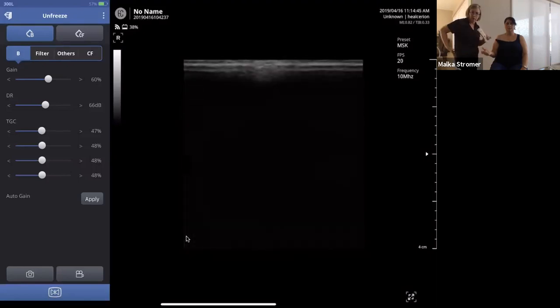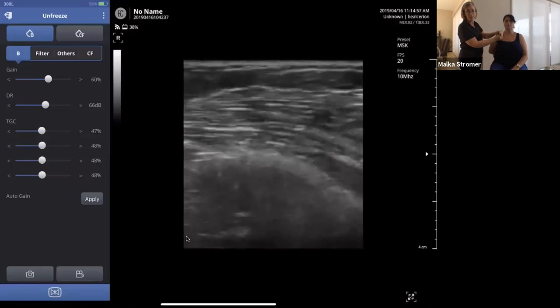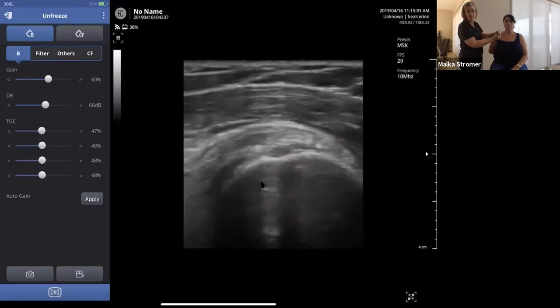Now we're going to have her check her pocket. Hand behind your back, please. Thank you. Going to start in a 45-degree angle here. On the bone, I'm going to start medial and come lateral. And look what comes into view.